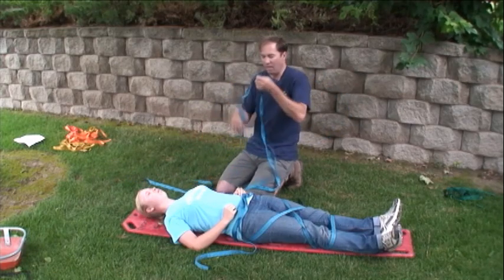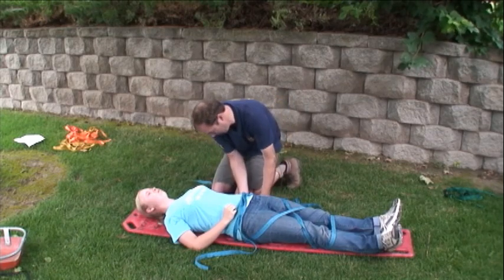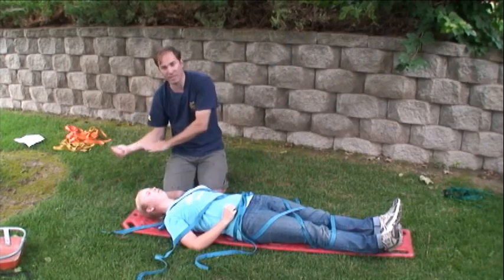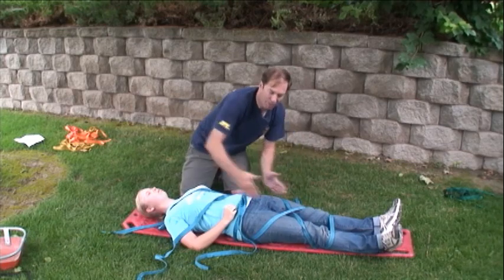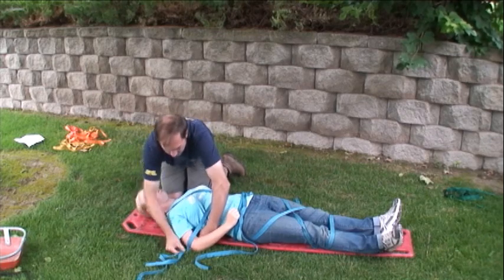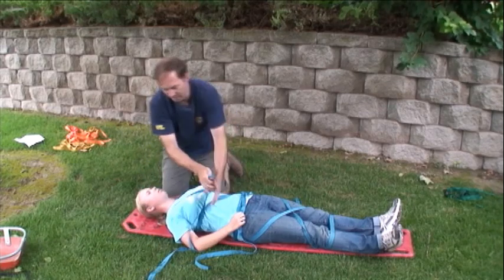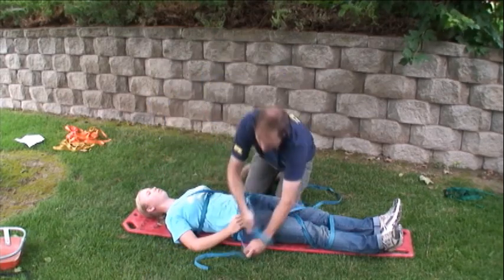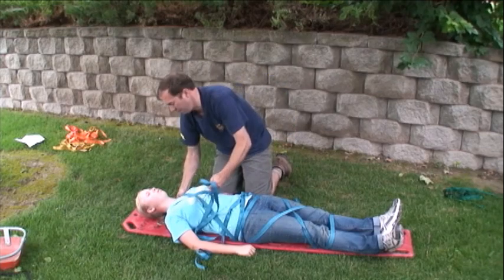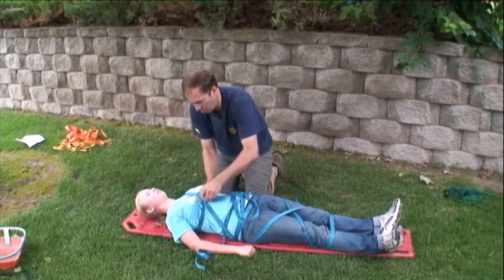Repeat for the torso. You can go through the middle of the board or make it come on the outside of the board if you have a larger patient, and tie it down for comfort. Go over the shoulders to hold your patient down and tie it off.